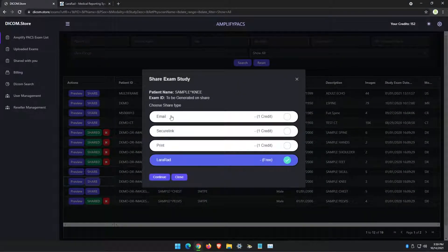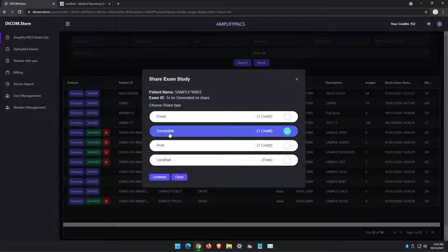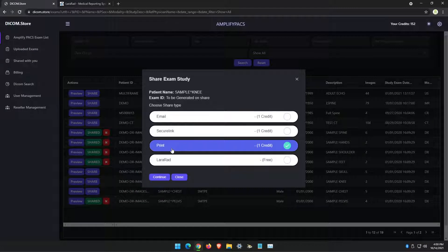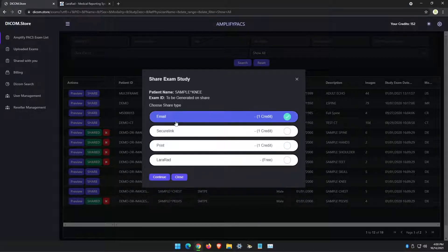You can email the exam, you can use the Secure link, or you can print instructions for the patient. I'm going to go through each one of these options to show you how they differ. For the first share, we're going to use email.